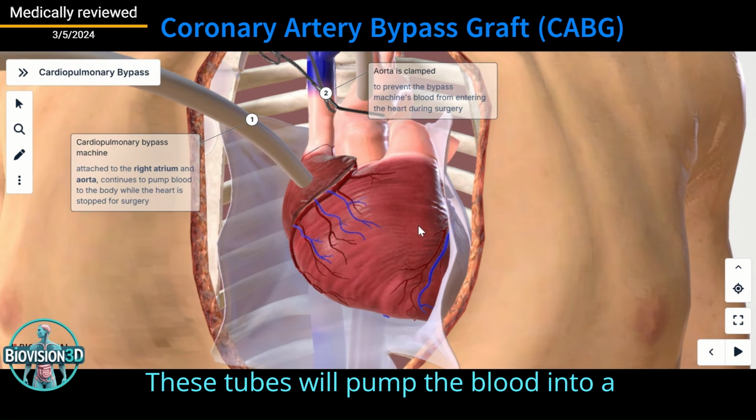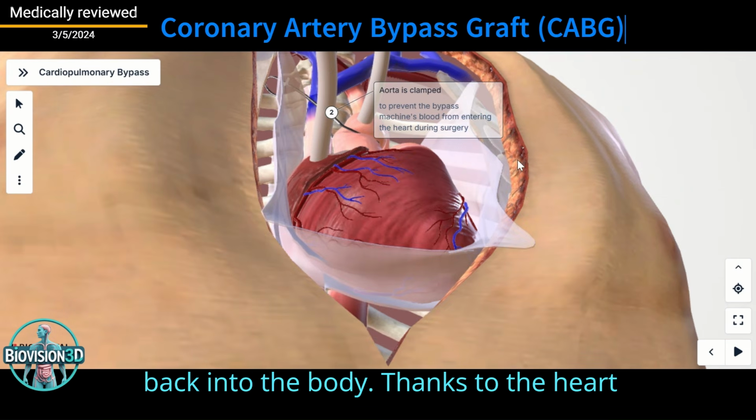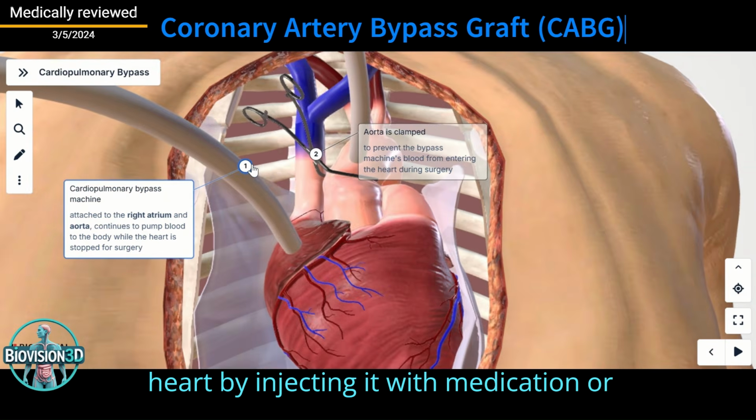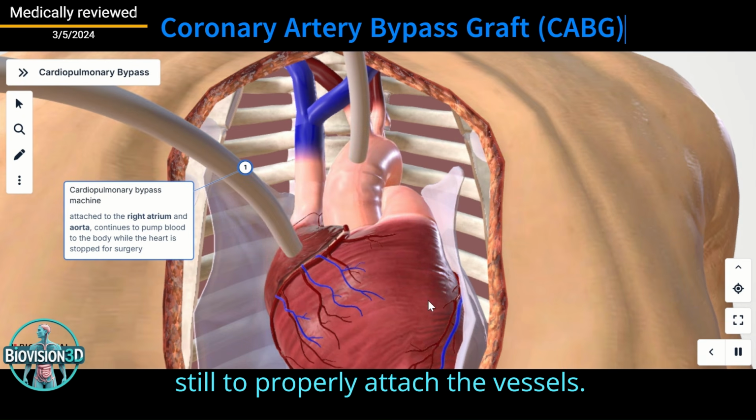These tubes will pump the blood into a machine that oxygenates and circulates it back into the body. Thanks to the heart-lung machine, the surgeon can stop the heart by injecting it with medication or a cold solution. The heart needs to be still to properly attach the vessels.